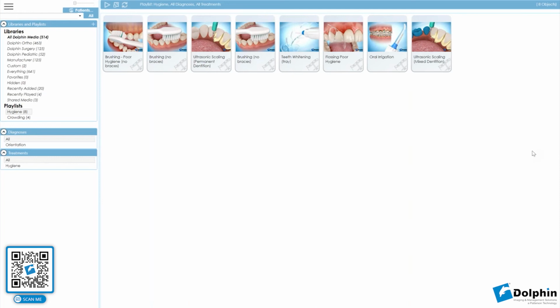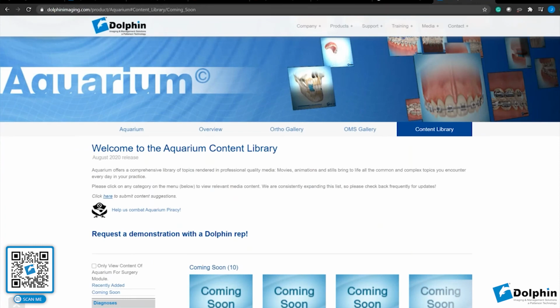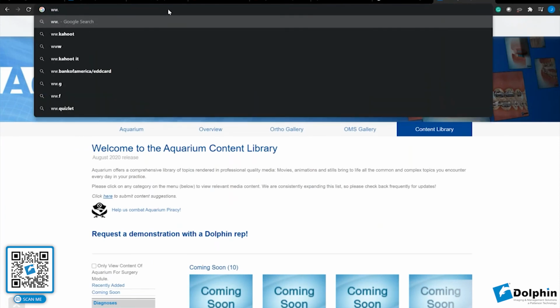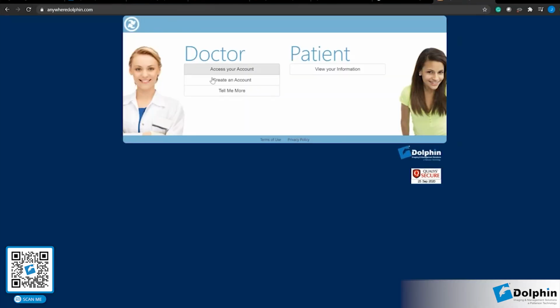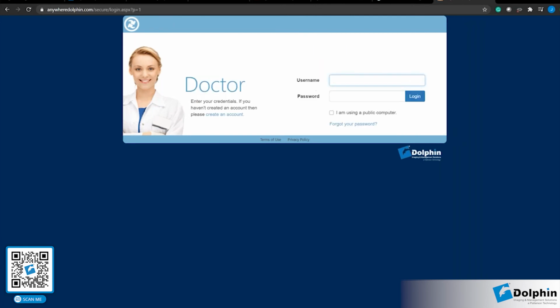Joe, there's another question from Boyd Whitlock. Where can we find more detailed training on aquarium? For all detailed training questions, again, please go visit our website, anywheredolphin.com. If we go ahead and visit, I'll show you right here, anywheredolphin.com, and you'll click on Access Your Account under Doctor, and you will type in your credentials.